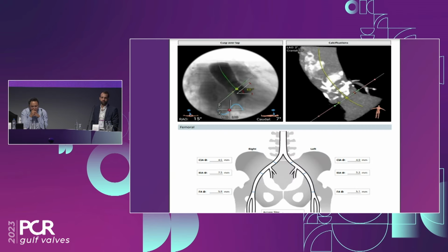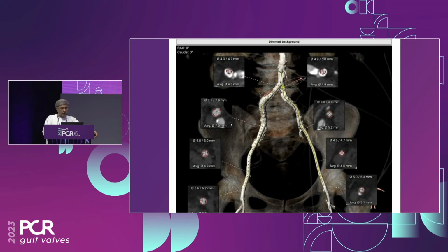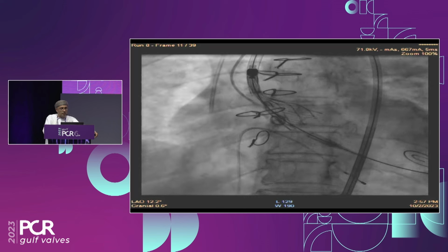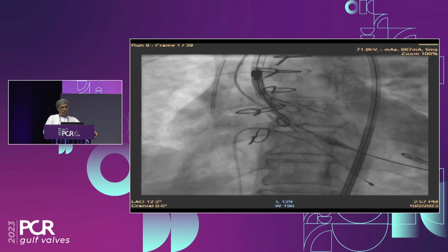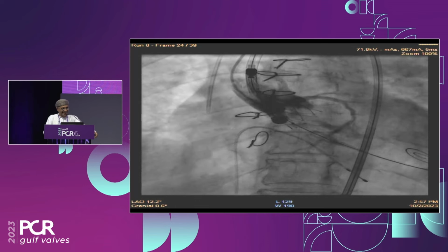Also, the peripheral vessels: from below, the bifurcation is lower. The only thing, there was a nidus of calcium just near the bifurcation. We had difficulty getting the pigtail from the left side because of the calcification, and we were really afraid that the system would not go through. But fortunately, it went. And I think there is osteoporosis also. Yes, she's 80-something. What do you expect?